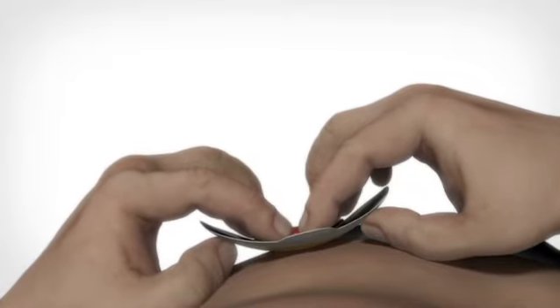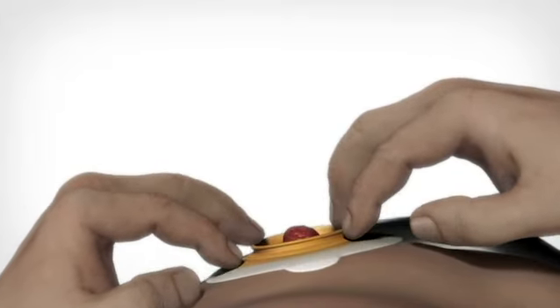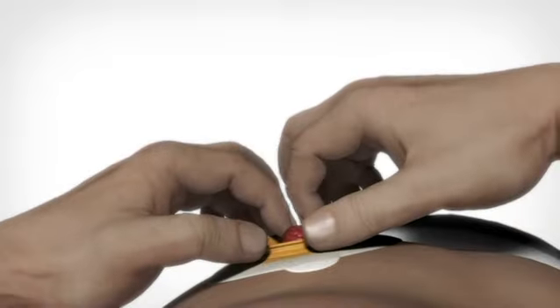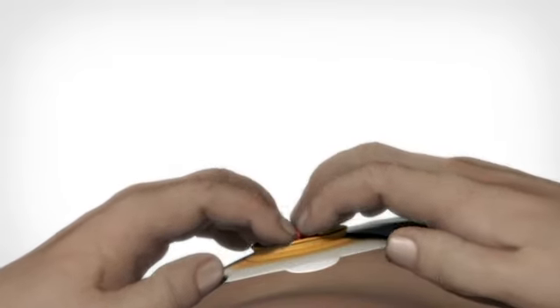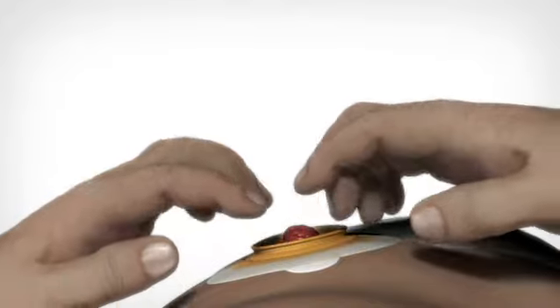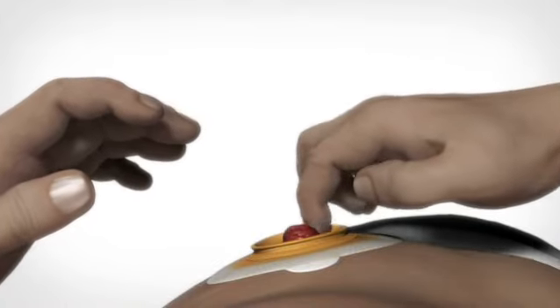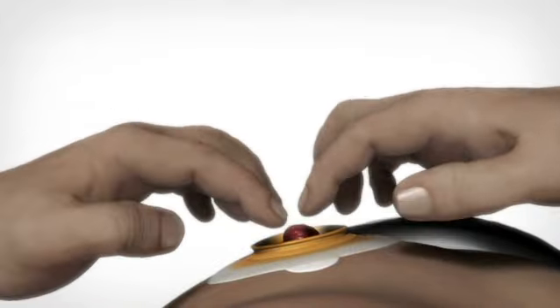When applying the adhesive, begin closest to the stoma by pressing the adhesive to the skin. Run a finger all the way around the stoma to ensure that the adhesive seals. You may want to use a mirror to check the sealing.